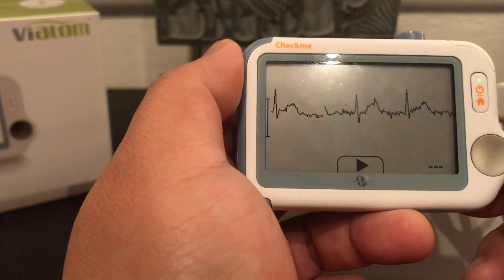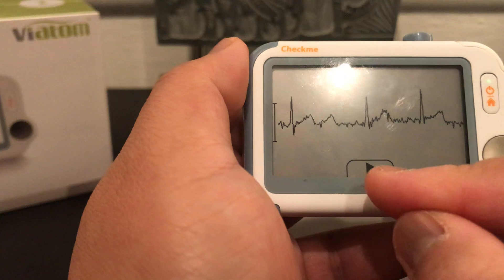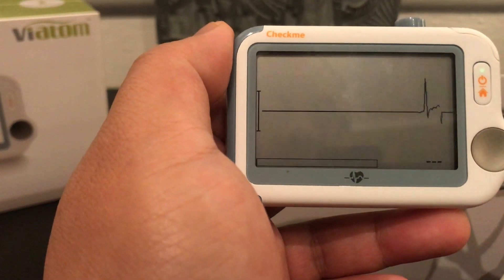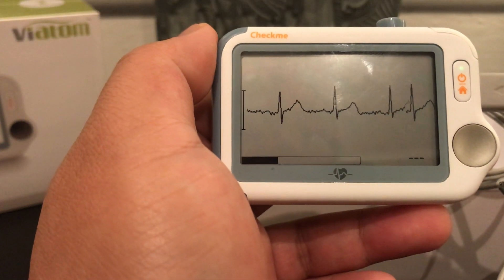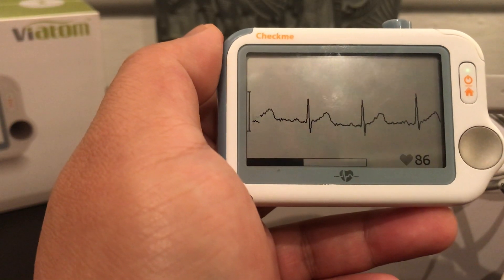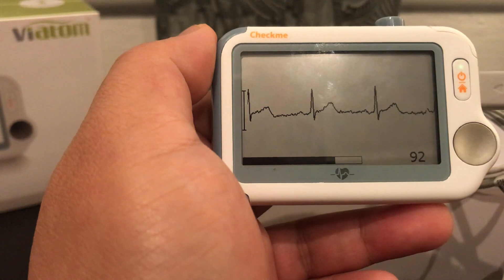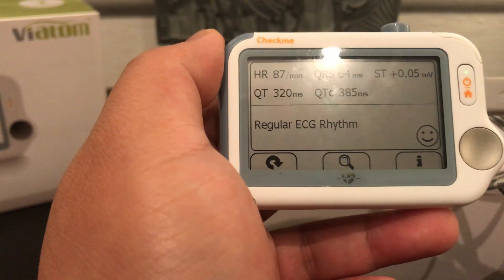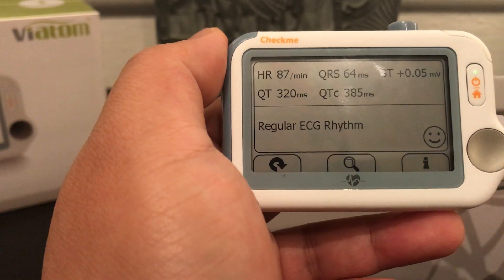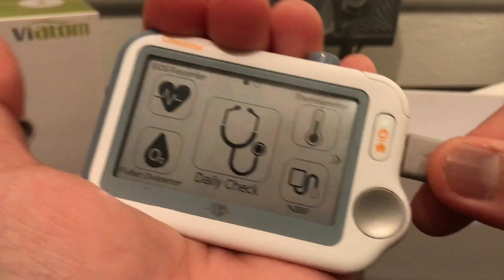Right now it's doing a live view of your ECG. Press this button down here and it's going to record it. This is set for 30 seconds — you can change it to 60 seconds under the settings section. You can see it's checking your ECG and also checking your pulse rate on the bottom right side. The results are on the screen and it's giving me regular ECG rhythm. You can detach the leads when done — you'll get 10 of these electrode pads as your starting kit.